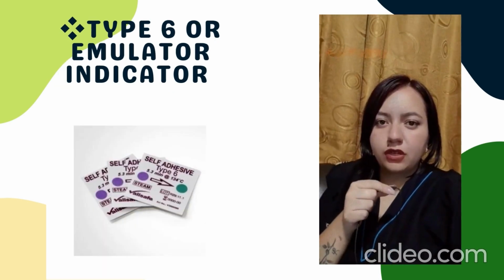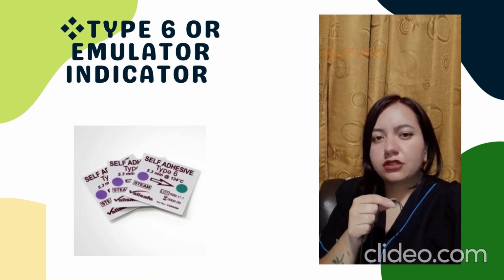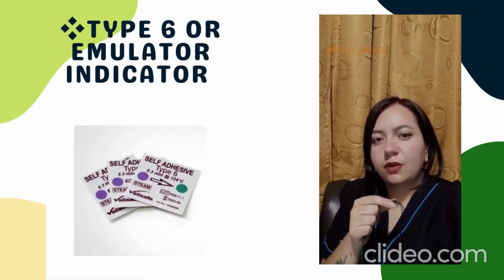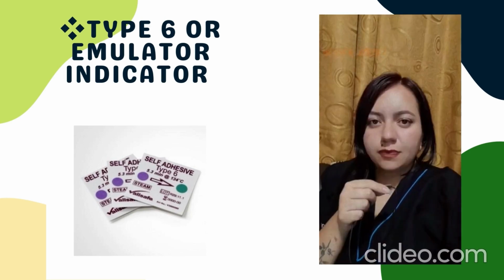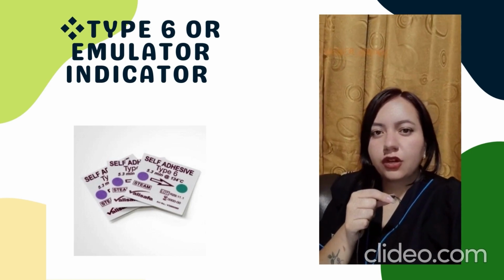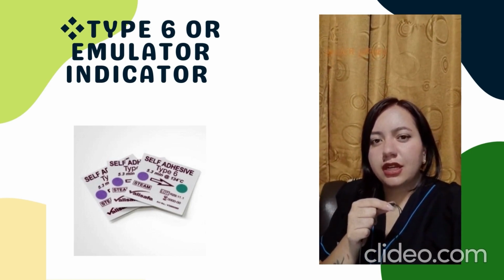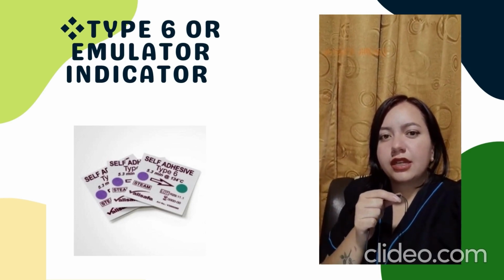The important feature of these indicators is that they change when the sterilization cycle is completed.